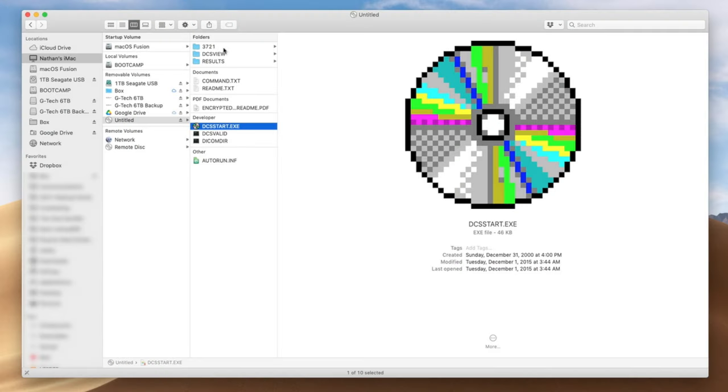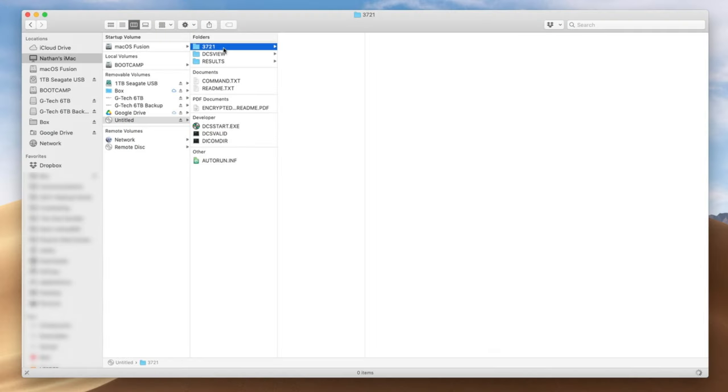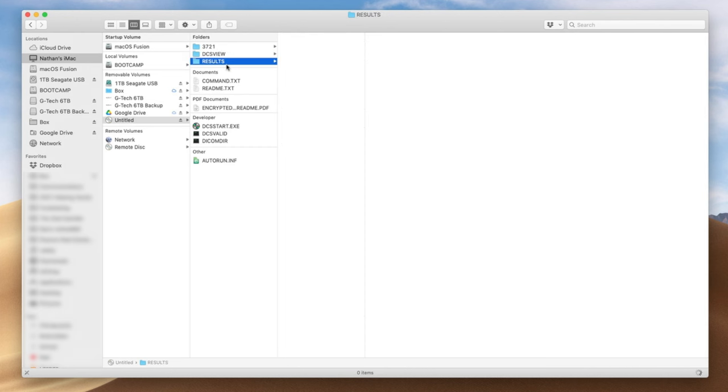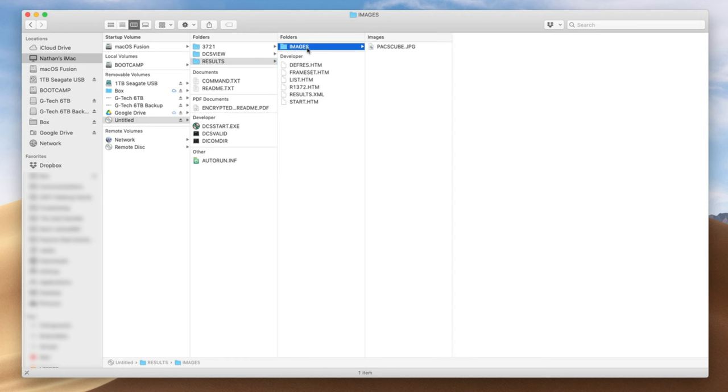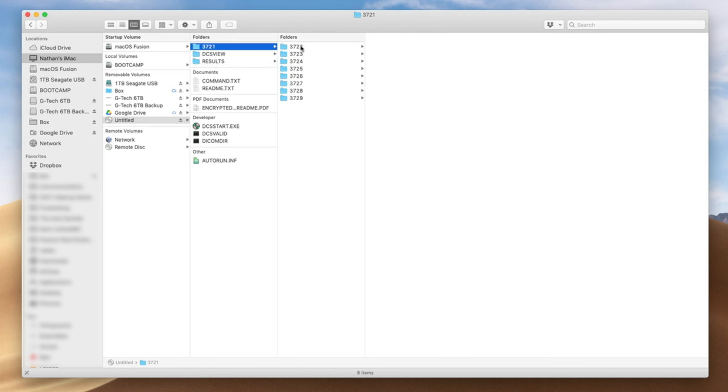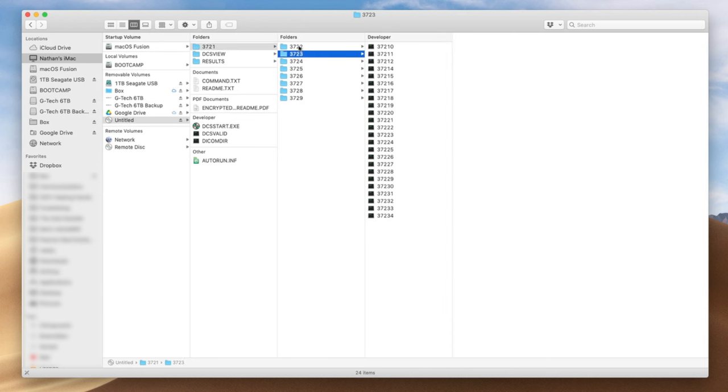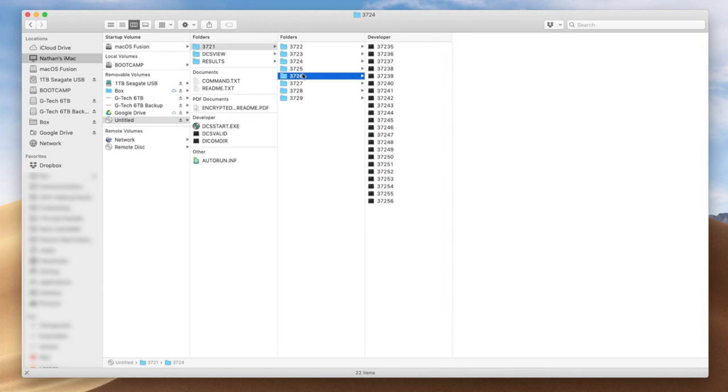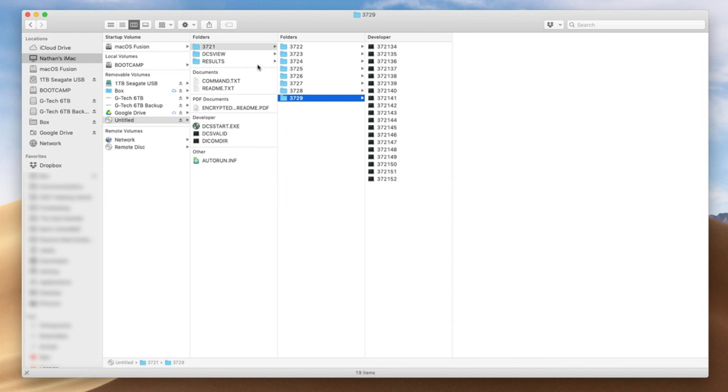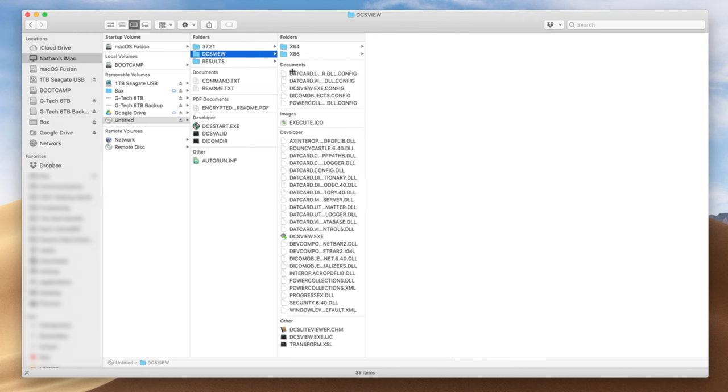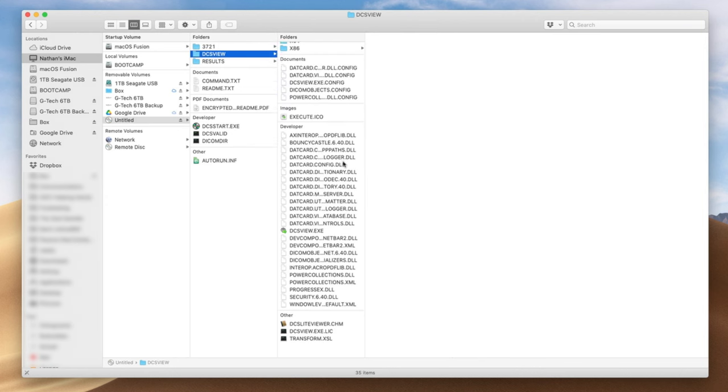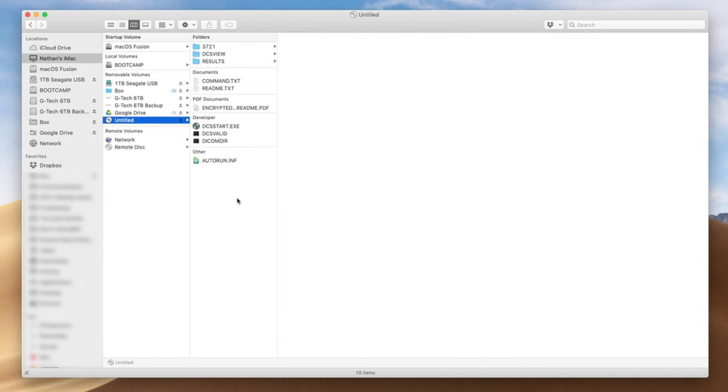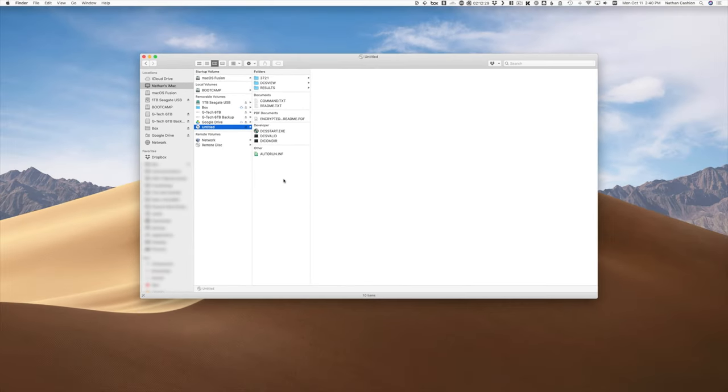But if we just go through the file folders here, you'll see some empty folders, you'll see results, you'll see some text to read me, but what we're looking for is a folder that has DICOM images. And these are not going to be readable just by the computer. But once we go in to a DICOM viewer, then we'll be able to open these images. So what is a DICOM viewer?